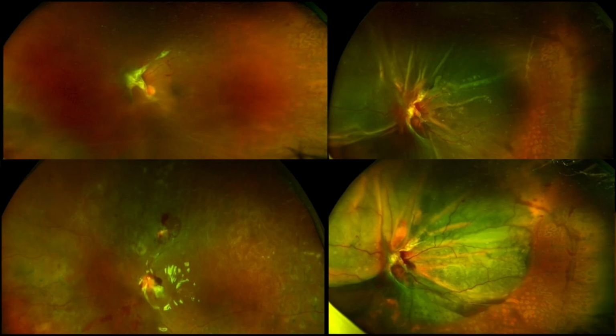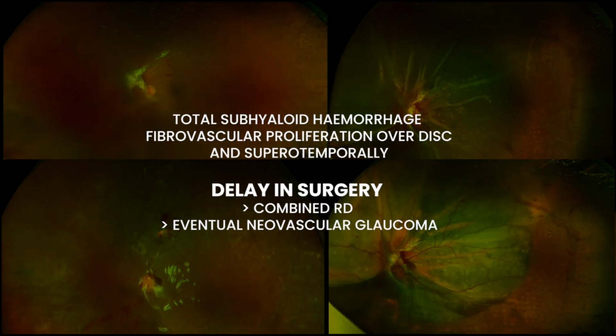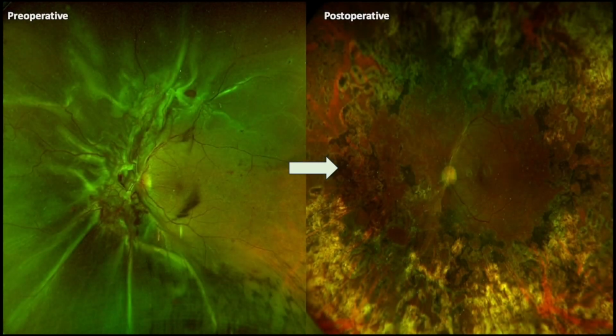The above case shows the importance of early surgery, as the patient presented with subhyaloid hemorrhage, fibrovascular proliferation over the disc and supratemporal region. On delaying the surgery, the patient presented with combined retinal detachment and later on leading to neovascular glaucoma.